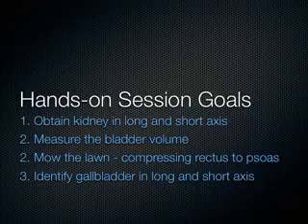Okay. Yes? Putting the right leg as far as you can over the left, why? I don't... Yeah, that's a great question. That comes up all the time. Why would you put the right leg over the left leg? I think it has an effect on the psoas muscle, brings the psoas muscle maybe a little bit more anteriorly. That's one of the things I can think.